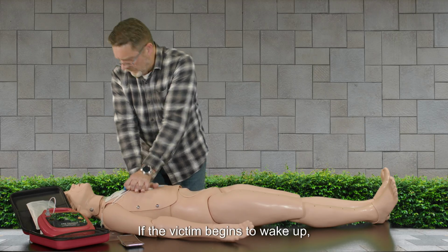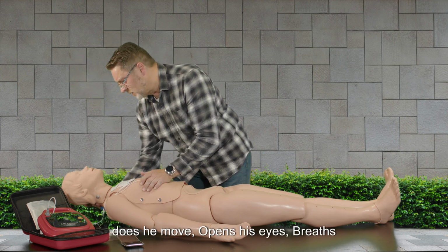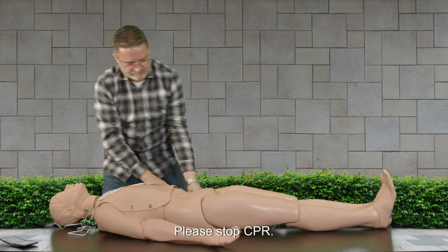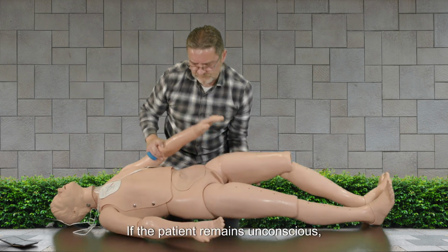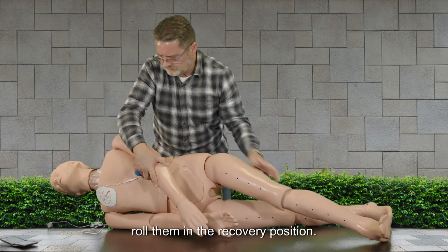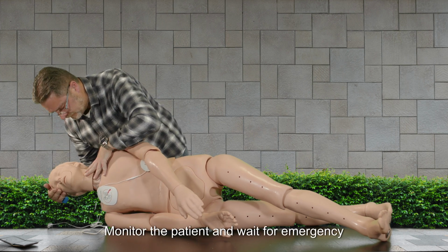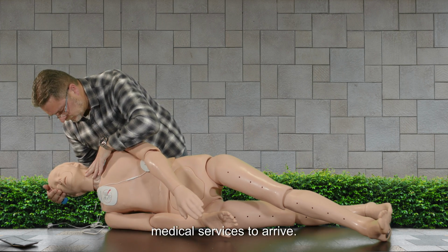If the victim begins to wake up, moves, opens their eyes, or breathes normally, please stop CPR. If the patient remains unconscious, roll them into the recovery position. Monitor the patient and wait for emergency medical services to arrive.